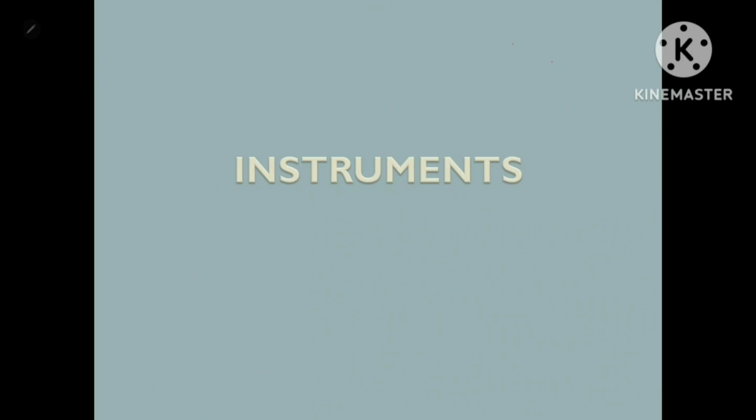Yes, today we are going to learn about the instruments which are commonly kept in the pathology exam for second year students.